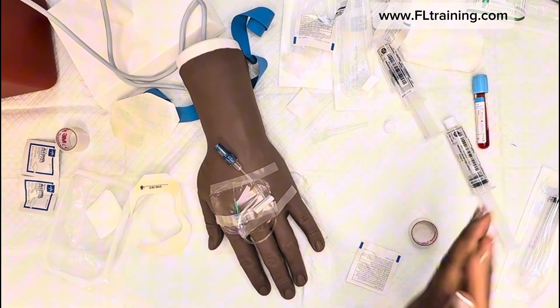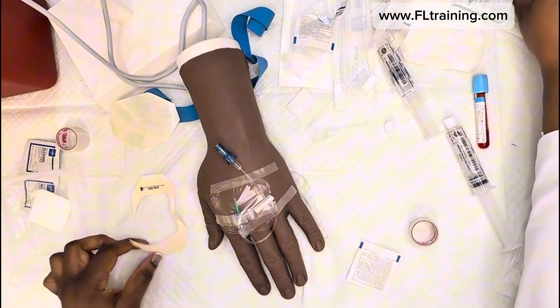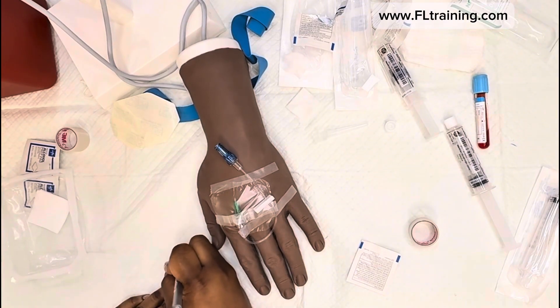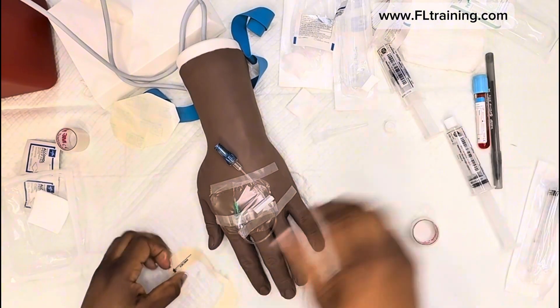I'm going to take off these gloves, put them in the trash, and sanitize my hands. Then I'll label everything. Let me go ahead and sign — we have today's date. The pen isn't working so just pretend it is.